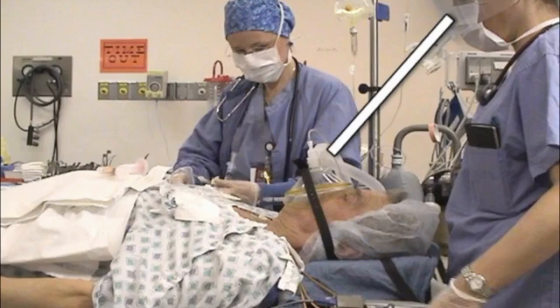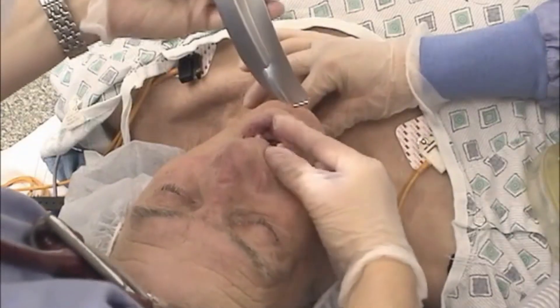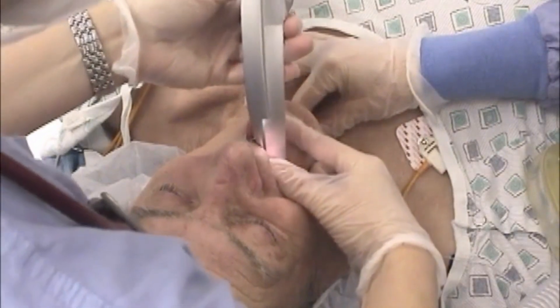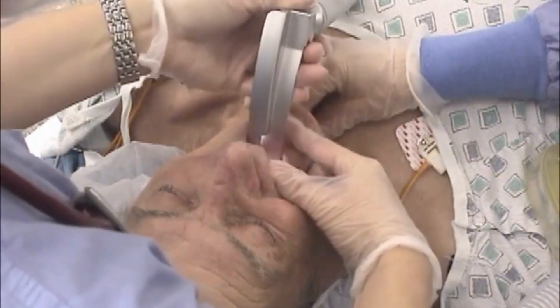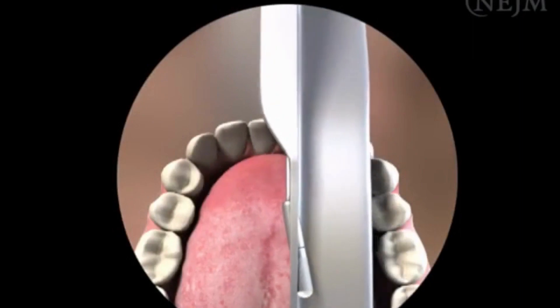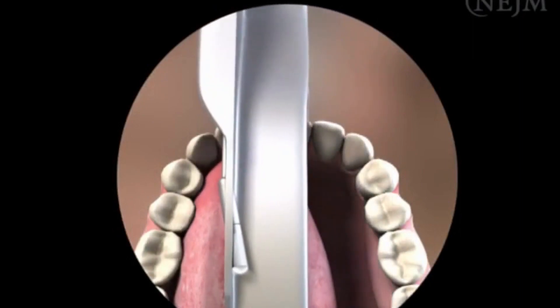Position your body so that your eyes are at a distance from the patient that facilitates vision. Hold the laryngoscope in your left hand, blade down. Open the patient's mouth with your right hand and insert the laryngoscope blade to the right of the patient's tongue. Gradually move the blade to the center of the mouth, pushing the tongue to the left.